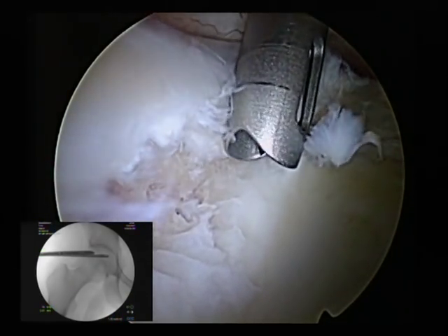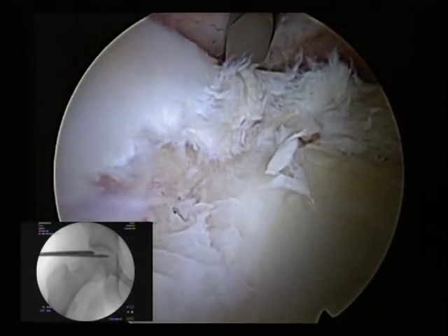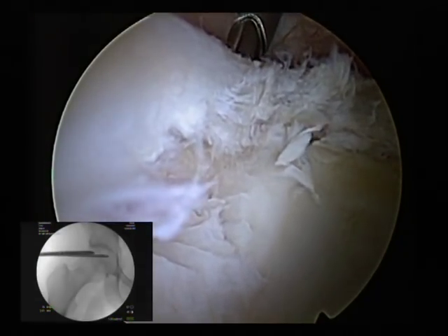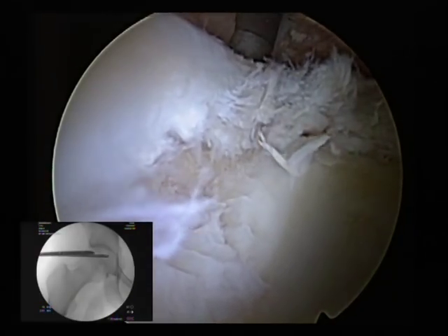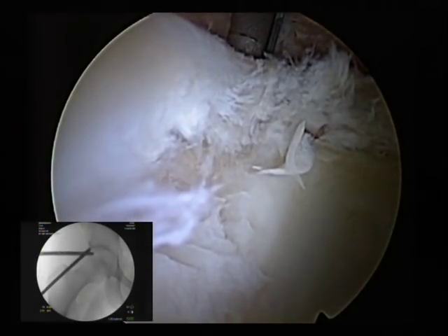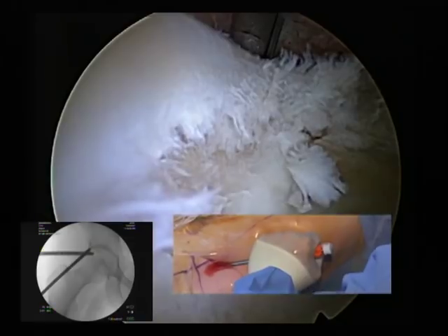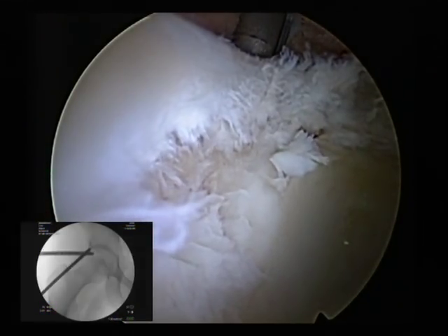I'm going to make one little punctate start here with my sharp trocar. Occasionally the angle just isn't very good, so what I might do in this patient is go above it and then bring that labrum away from the joint, which is really what I want to do. I want to avoid any kind of mechanical irritation, so I know it's going to be immediately behind my labrum. I go ahead and take an image — you can see in the left corner that we have a good angle. If I miss in any direction, I'm going to skive off the articular margin and not cause any damage to the articular surface.